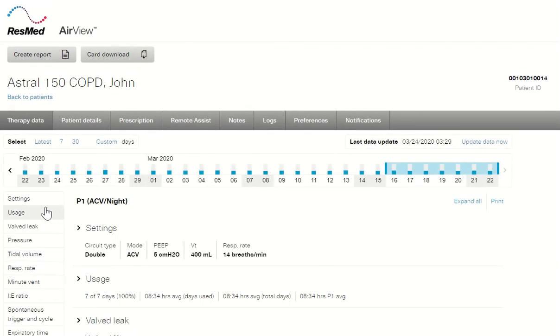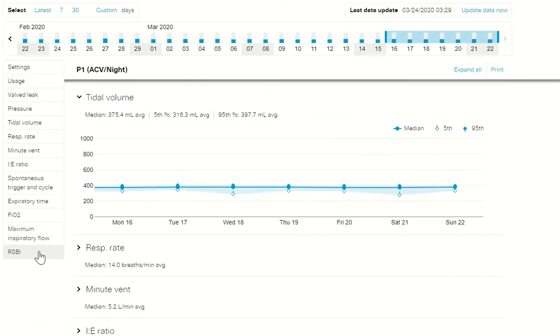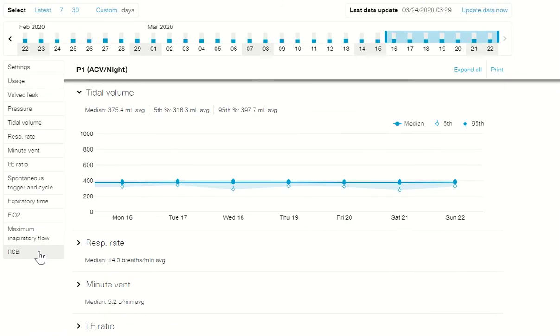Evaluate your patient's clinical data over your chosen timeframe from 90 days to one day. Select the clinical metric that interests you and drag or expand the timeframe to cover your chosen period.